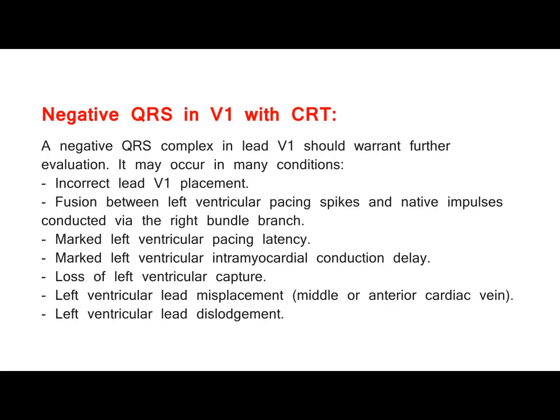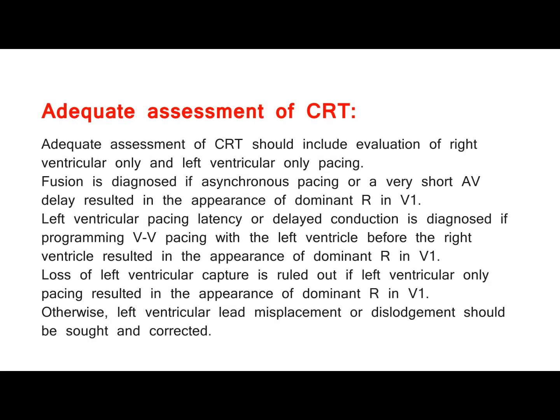Marked left ventricular pacing latency. Marked left ventricular intramyocardial conduction delay. Loss of left ventricular capture. Left ventricular lead misplacement, middle or anterior cardiac vein. Left ventricular lead dislodgement.